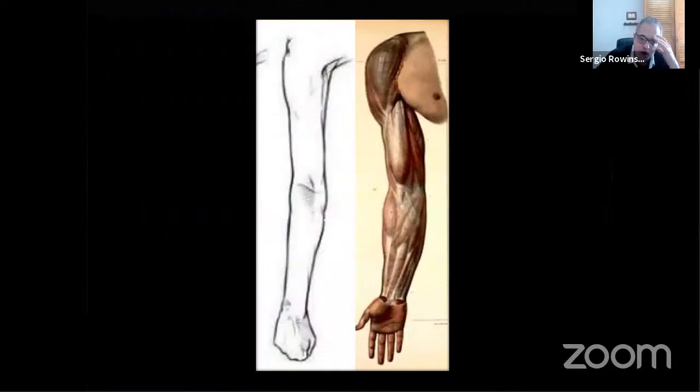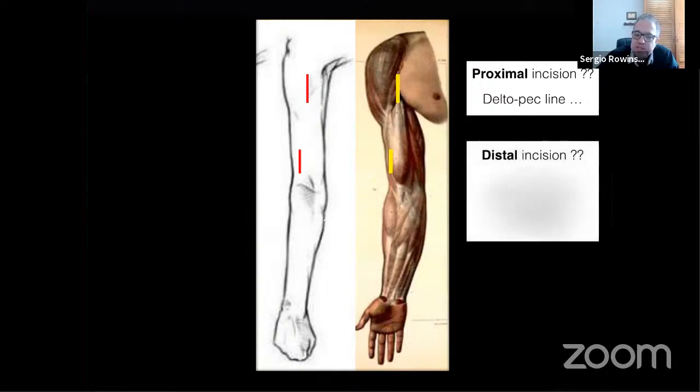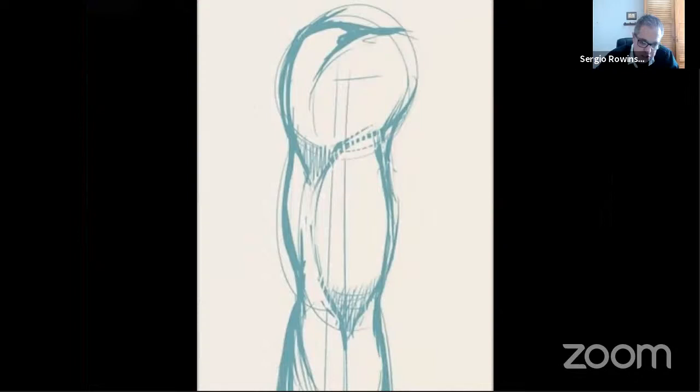From an anatomical point of view, I do exactly like Dr. Belangero in the proximal incision, in the deltopectoral line. This is going to be my proximal incision. But I do a little bit different from Dr. Belangero in the distal one. I go in the interval between the bicipital muscles, biceps and brachialis, with the distal lateral triceps. And if we see in this picture, this is my distal incision.